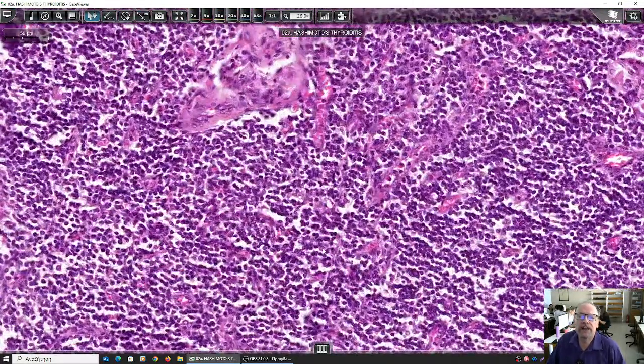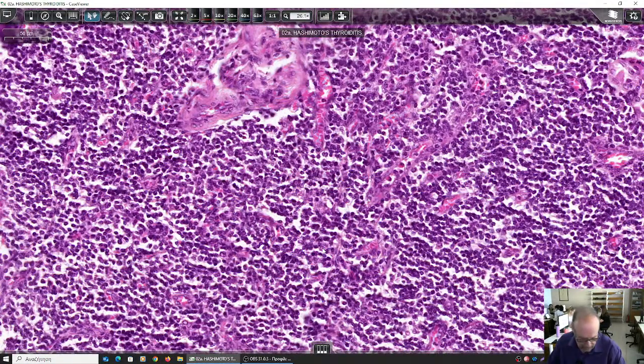So what other cells are expected to be here so that they attack? Because this is an autoimmune disorder. That means the immune populations of the host attack some structures of the host himself. So what cells do you expect to be here? These, I cannot tell that they are B cells because they do not form lymphoid follicles.